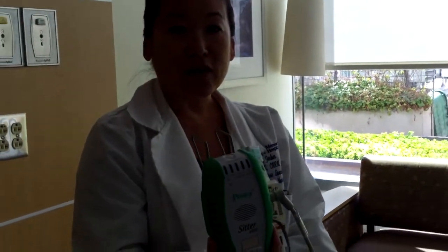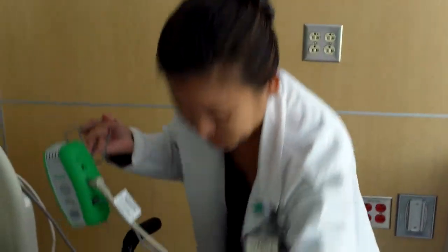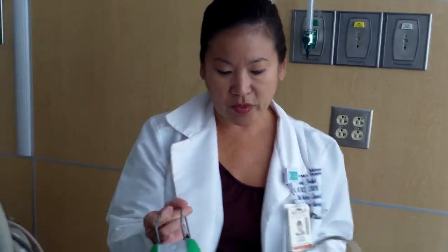So we're going to be going over our Sitter Elite, and we actually have a new adapter cord since we're on 3 North that we're going to be using, and it actually goes into the call light system. Anybody that has a wheelchair seat belt while they're in the room needs to have the adapter connected into the wall so that when it goes off we can hear it through the call system.